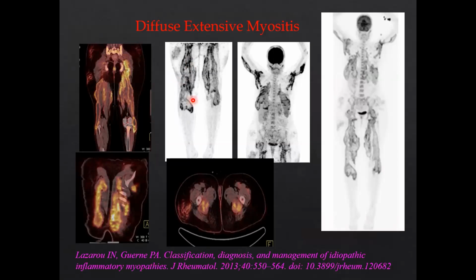The reason was not known. The patient was having fever on and off, and the patient was poor, not able to come to the hospital, and had financial constraints. At a later stage he was referred to the hospital, and from there he came to our tertiary center for evaluation. It was showing multiple streaky collections. It's not only infection or inflammation, it is purely collections like some sort of an abscess, probably disseminated, involving all the muscles of the body.